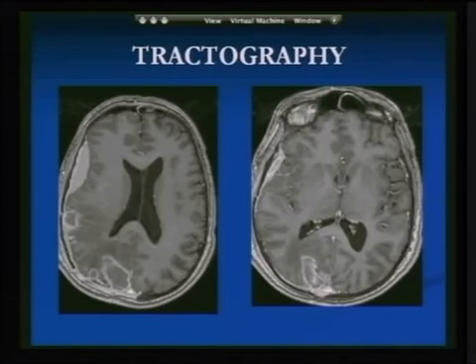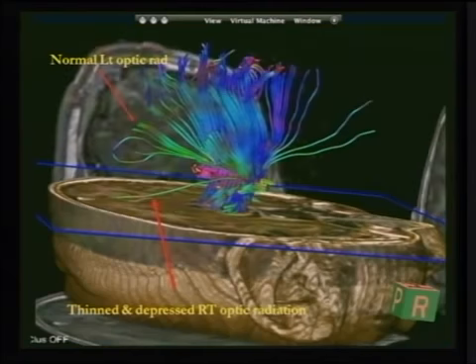Another patient with a road traffic accident, multiple epidural collections, and a right occipital intra-axial hematoma. The surgeons want to evacuate this hematoma, but want to know where the optic radiation is. What is the relation of that hematoma to the optic radiation? This is the answer.